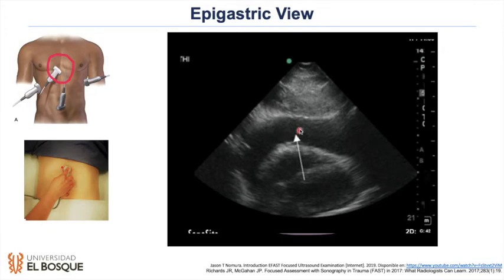But as you can see here, this is the liver and this is the heart. So here is a very large black region that is separating the 2 organs. So this means that you have a cardiac tamponade. So if you have black in a space between 2 organs, that is going to mean that there is fluid, and it is normally blood.